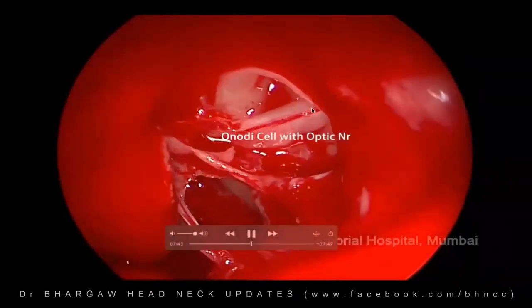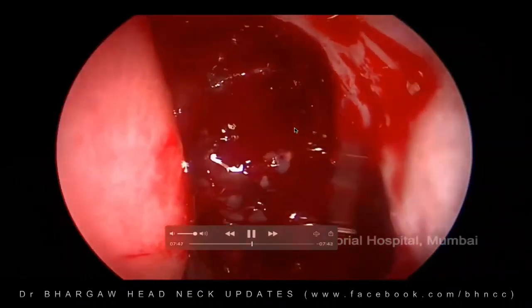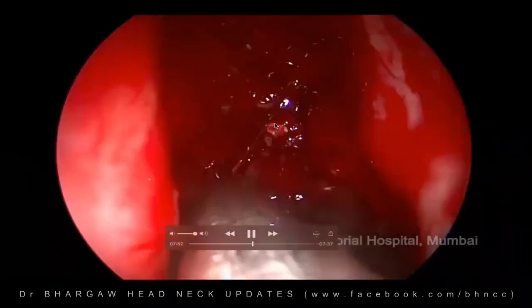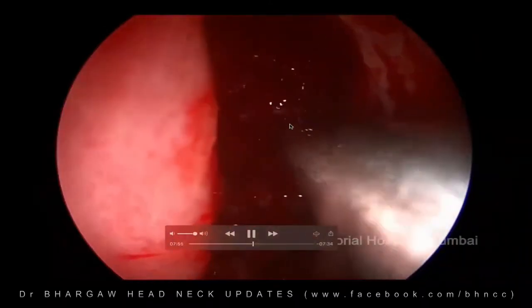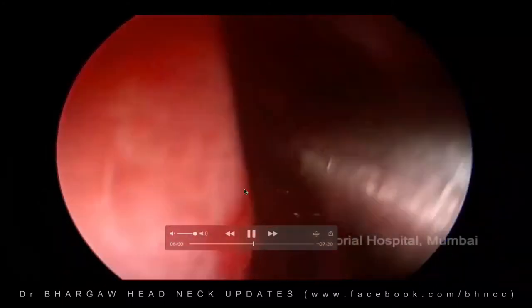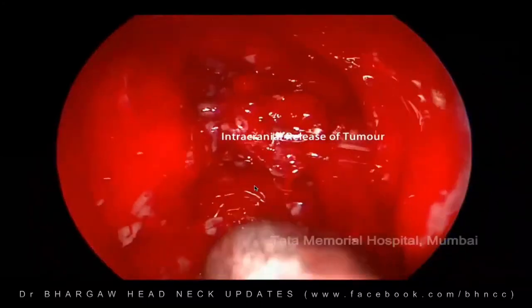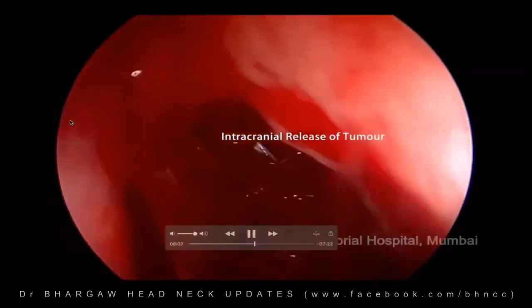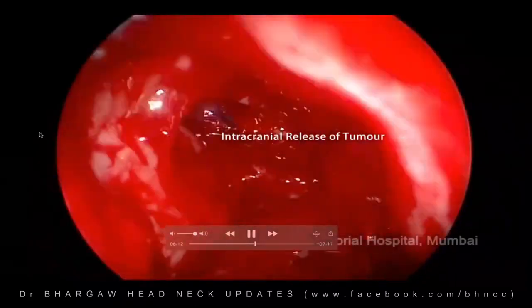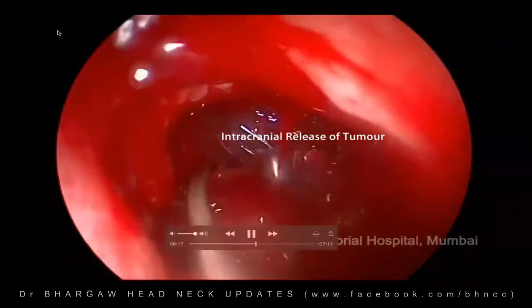That's the Onodi cell with the optic nerve being so bare that you can just appreciate this. If you're not aware of this, we would go and damage the optic nerve. Now there, the tumor that was already dissected, we have debulked it and kept it ready for it to be delivered from above. This is attached to the septum as well. So we have resected it from the septum superiorly, and we'll get all the margins cleared as well. And the tumor will be delivered intracranially.